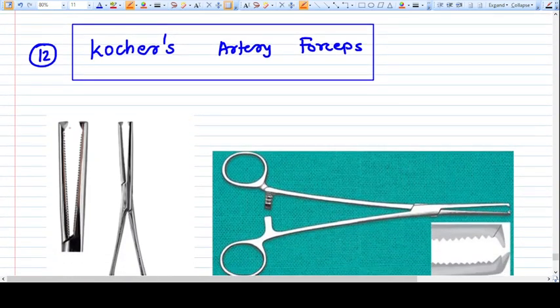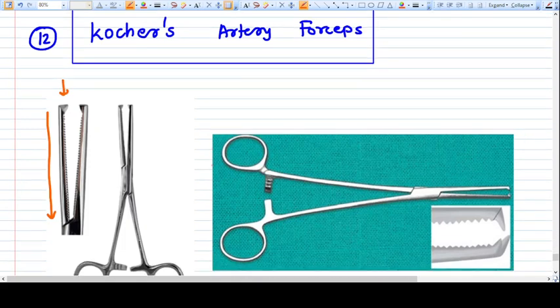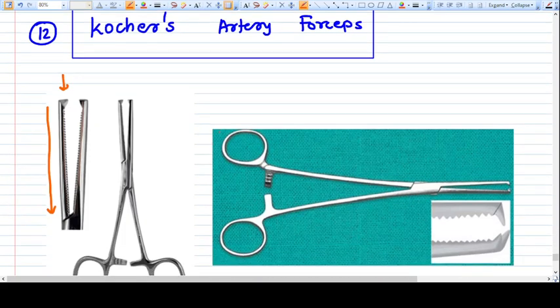In this instrument, you can see there are long blades with serration inside - they will be opposing to each other firmly - and also at the tip there are three teeth. So Cocher's forceps is a very good forceps. It will hold everything tight and it will not slip. Cocher's forceps is a combined design of Alice forceps and hemostatic forceps.